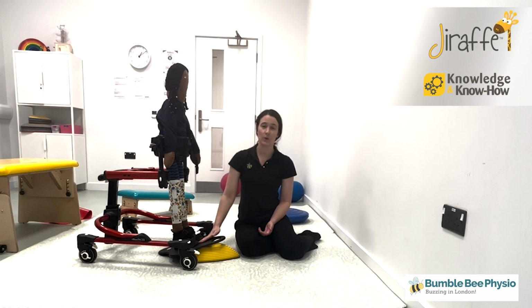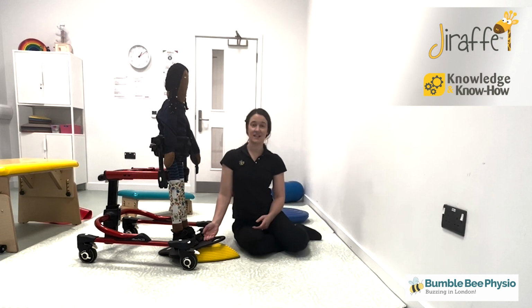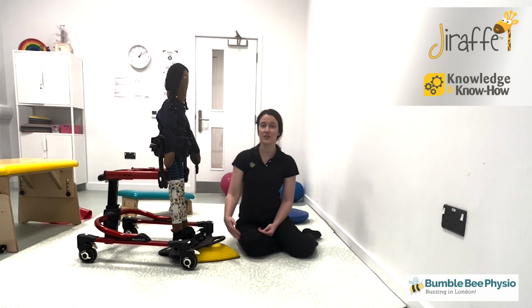We might also want to put some pronation supporting insoles in, because if the ankles go into pronation, it's a compensation for the gastrocnemius stretch, and it will actually take the stretch off. So we might want to think about insoles as well. And then in addition to this, just to show you every single option available, I've actually propped it up onto a stepping stone to make a wedge as well. You can do this in any way.